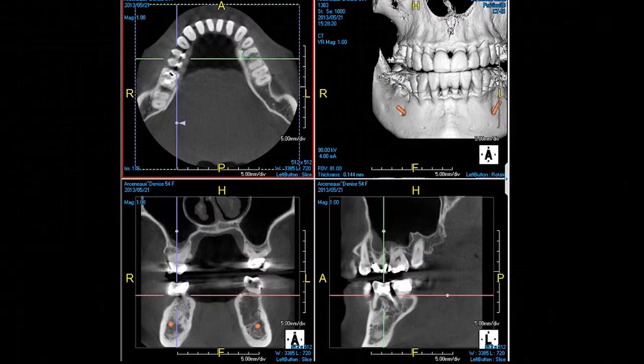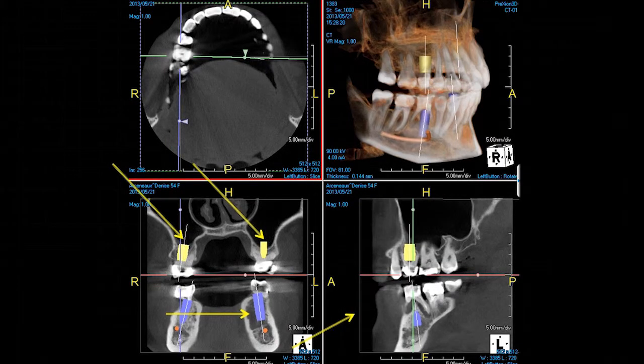So we're looking at these sites. Down here looks good. This is interesting here. Look at the difference in density here. We wind up using a real large diameter implant in this area to engage the cortices in this particular site. And we know right here we're going to be doing antral augmentation through the osteotomy at the same time that these implants are placed. So here we are at 6 weeks.